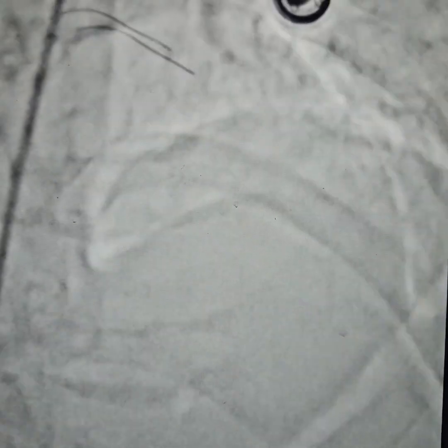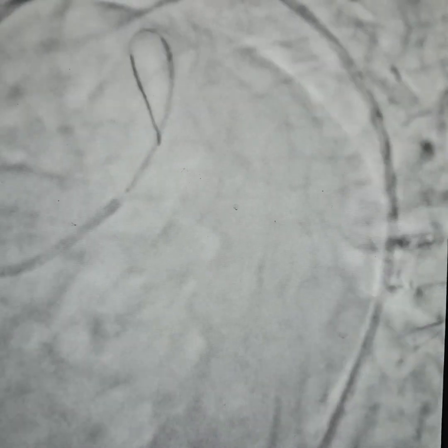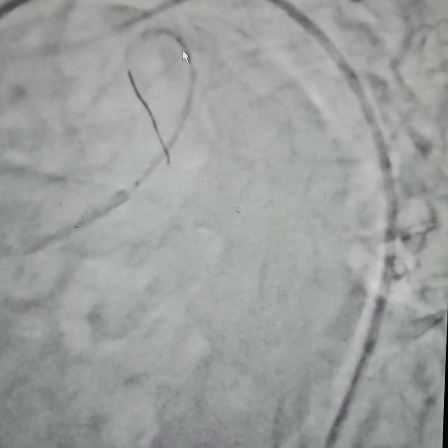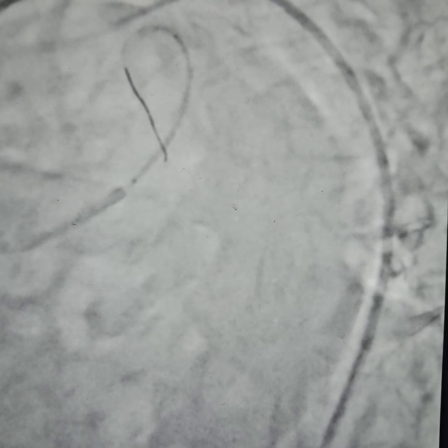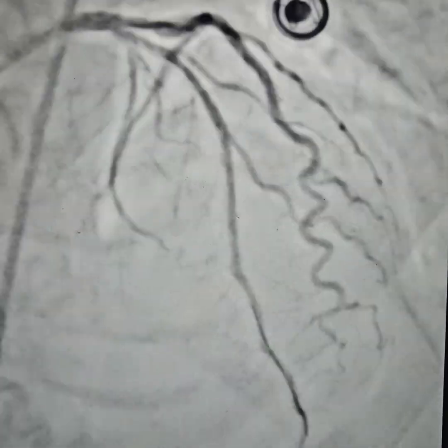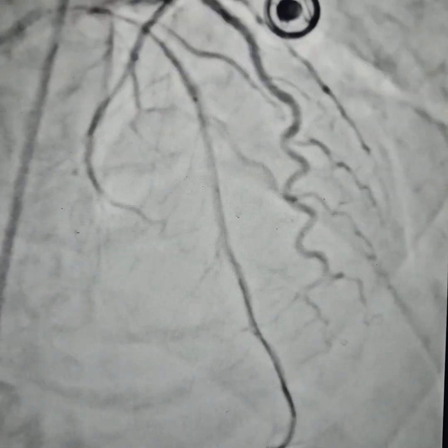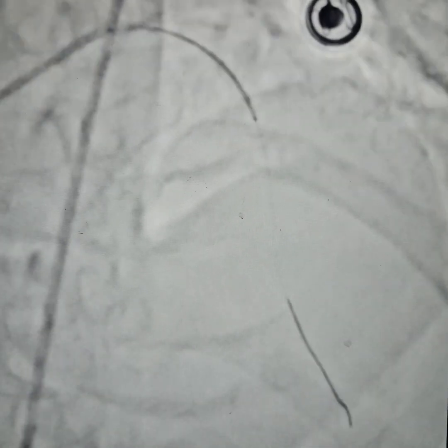So here we are. That is the stent you can see right here — it's a long stent, a 3.5 by 44mm stent. You can see that it is almost covering — in fact, fully covering — all of the lesion that we wanted to treat.